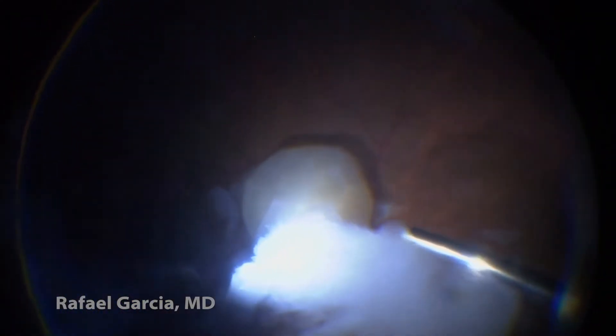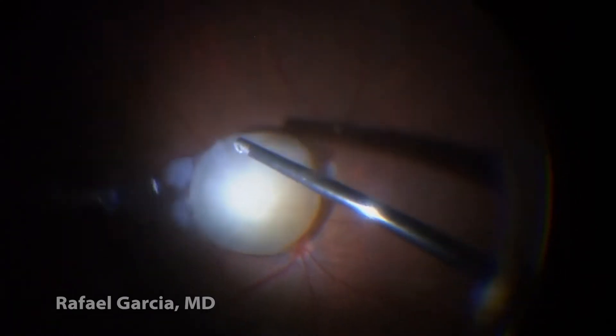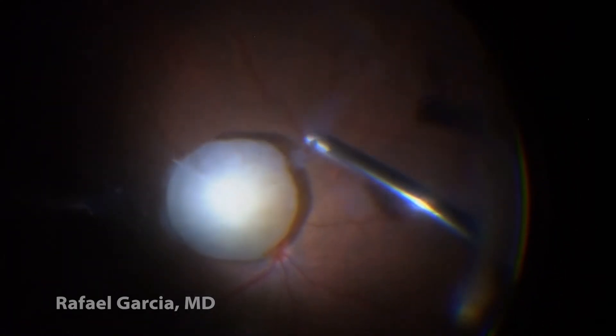Next, the soft cortex material can be easily dealt with using the 23-gauge vitrectomy probe. If the patient doesn't have a PVD, we should always induce one prior to dealing with the nucleus itself.